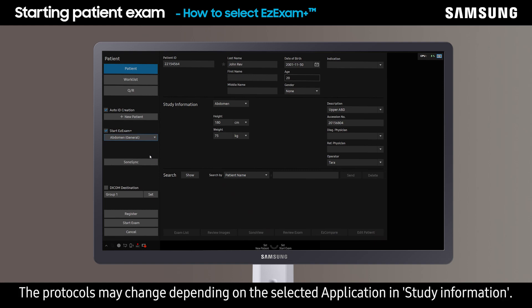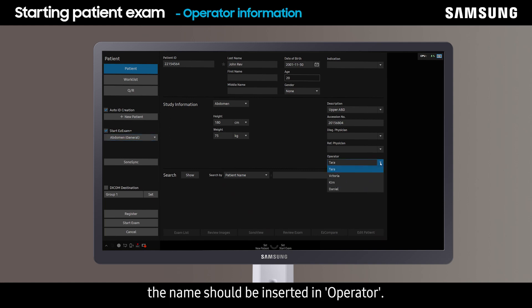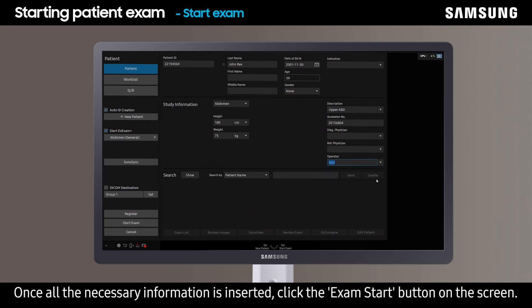The protocols may change depending on the selected application and study information. If the name of the sonographer or operator needs to be displayed on the monitor, the name should be inserted in operator. Once all the necessary information is inserted, click the exam start button on the screen.